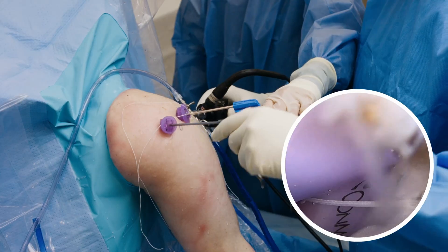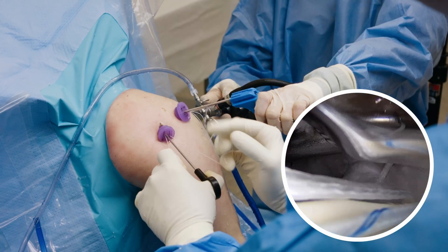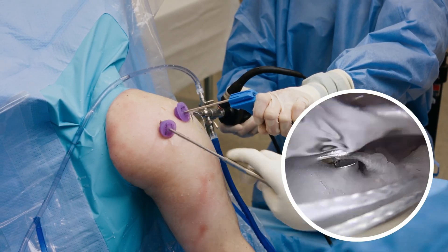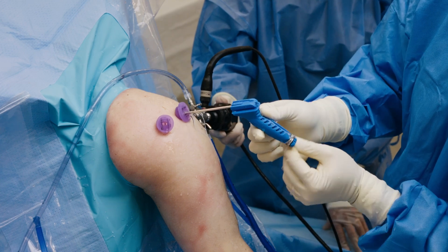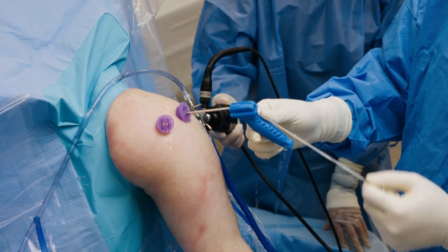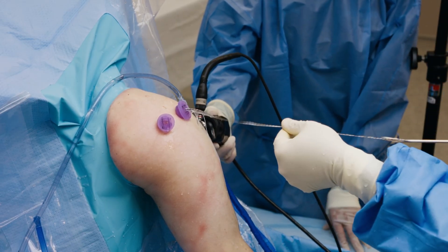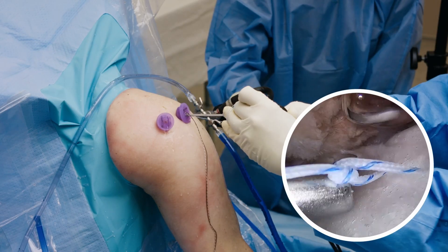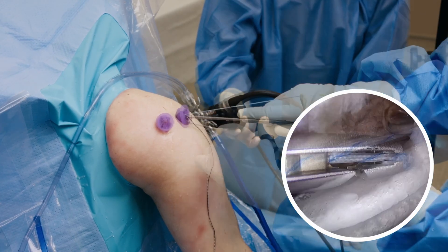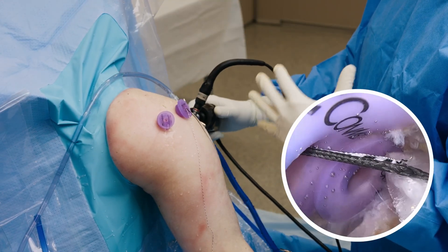We're going to grab each of the anterior white sutures through an accessory portal and secure it in this anterior location. Once we have secured the biobrace over the rotator cuff in this location, we can uncleat these sutures on the handle. These sutures are preloaded in the lateral aspect of the biobrace to make it even quicker for biobrace tissue augmentation of a rotator cuff repair. There's also a white suture that comes preloaded within the handle — that's just a retention suture that we will remove. We will secure the posterior location of the medial fixation point for the biobrace, and at this point we can see those lateral sutures.